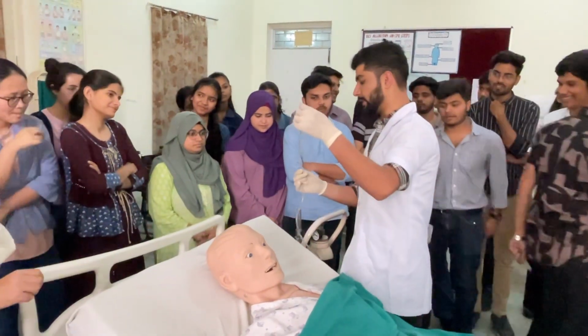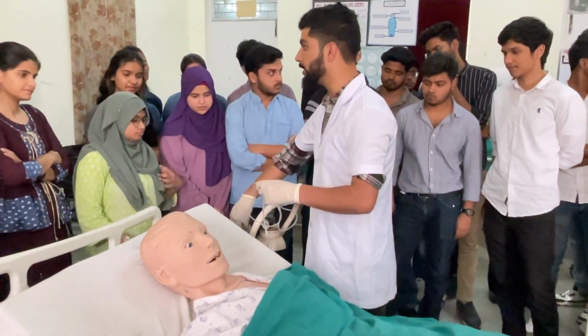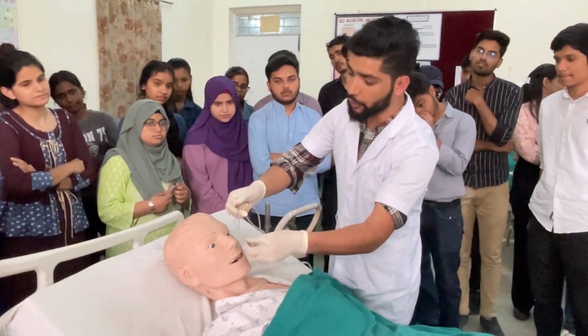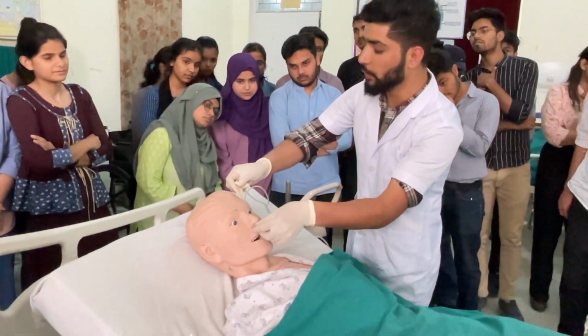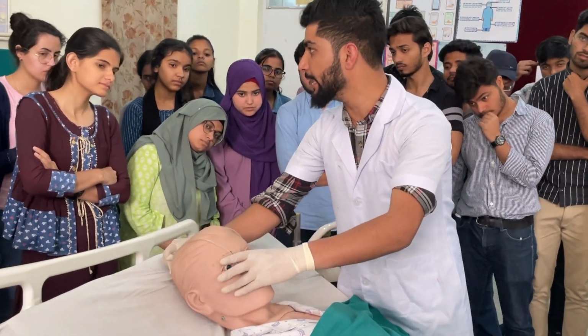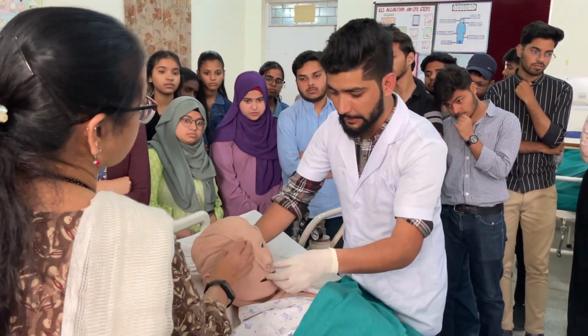This one is the nasal prong, this one is the connector, and this connector is connected with the humidifier. After that, this is the nasal prong, and the nasal prong should be inserted into the nostrils. It should be placed behind the ear. See this, see the face.